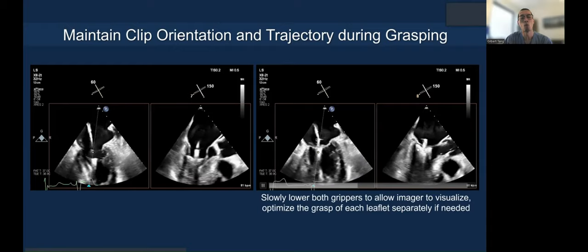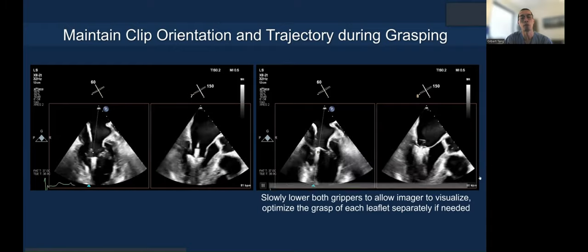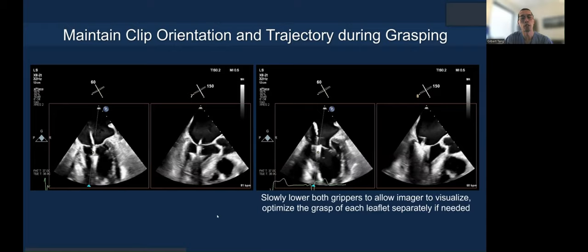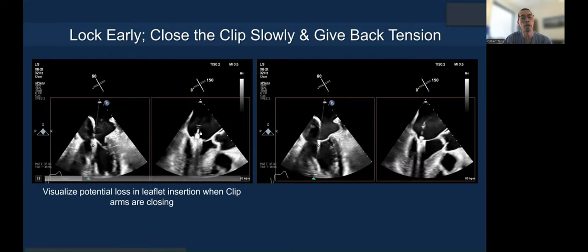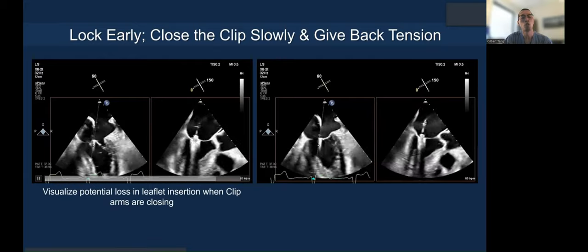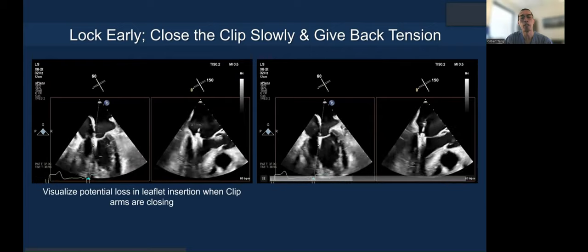You can see the leaflet tips are well inserted into the groove of the clip — clearly a nice grasp. If you have any doubt, you can optimize. When you close the clip and give back tension, make sure you have not lost any leaflet insertion.